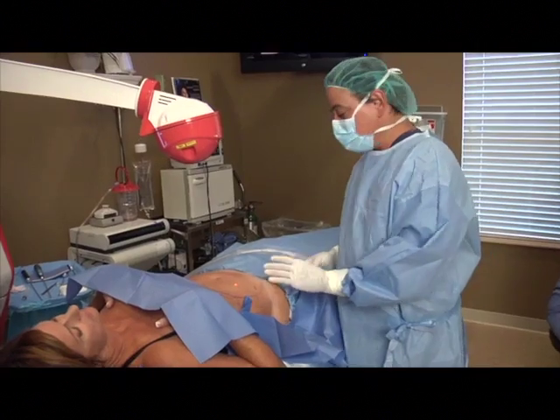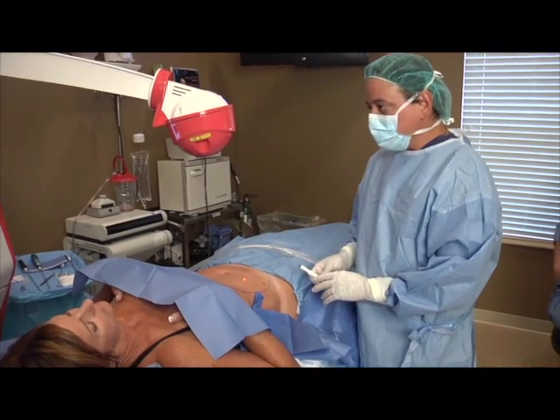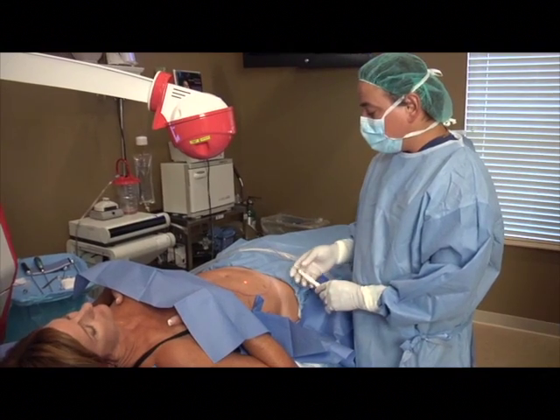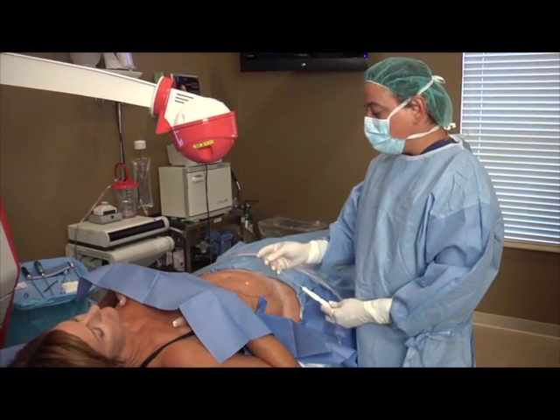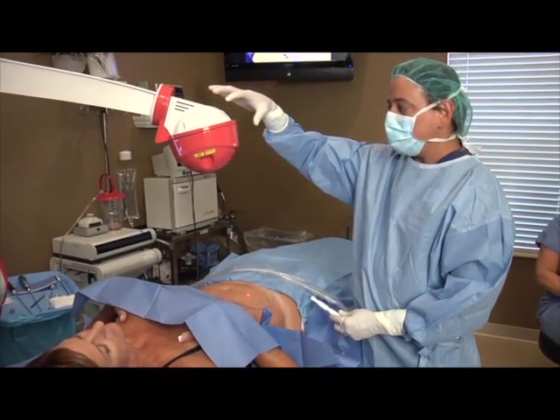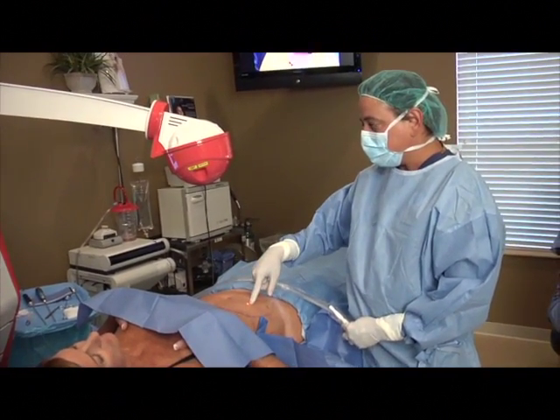Okay, we finished numbing Betsy's abdomen, and we're now ready to do the lipo control, the GPS lipo part of the procedure. This is the laser probe. There's a little red light here. This is the GPS camera that's positioned over her abdomen, and the little red light tells us that the camera's on.